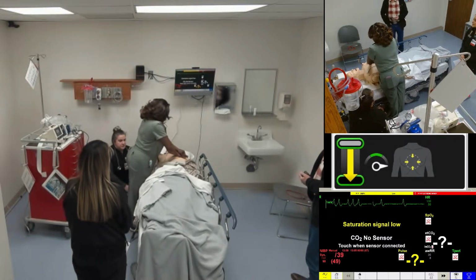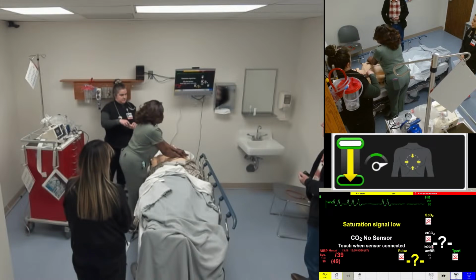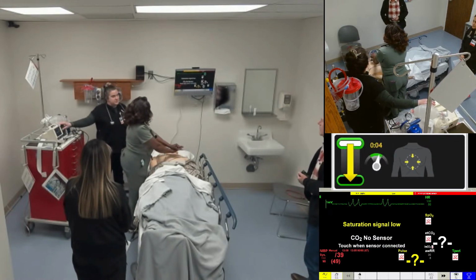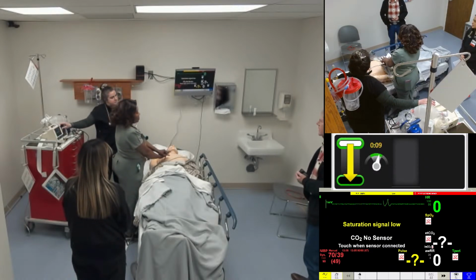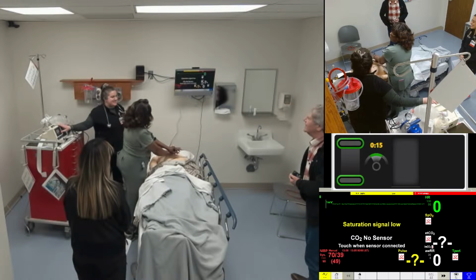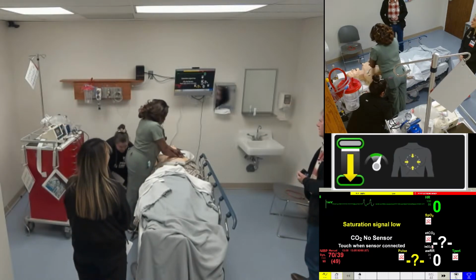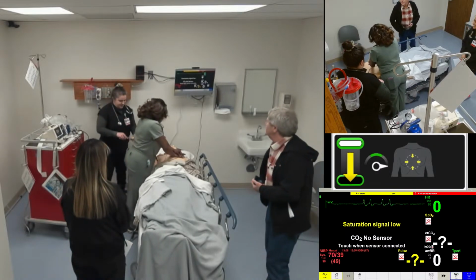Good. So let's say you've done 3 minutes, you're checking your rhythm. Analyzing now. Stand clear. You don't need to turn on the analyze defibrillator. Advise. You can just look at your EKG. What is your rhythm? It's still asystole. Okay, so what are you gonna do now? Another epinephrine. Good. Okay. So another dose of epinephrine.